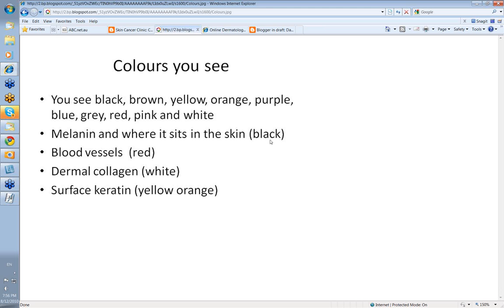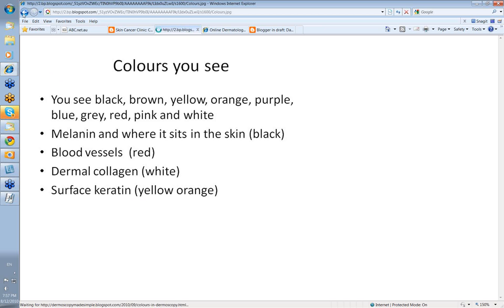The major thing is that black is determined usually by melanin and where it sits in the skin — the higher up in the skin the melanin is, the blacker it is. Blood vessels contribute most of the reds you're going to see in a dermatoscopic view. Dermocollagen may give you some white, but keratin will sometimes give you white as well when it's high up in the epidermis, as in little retained milia cysts. Most surface keratin will be yellow, orange, or a browny-black color, and you tend to see it best in lesions such as seborrheic keratosis.